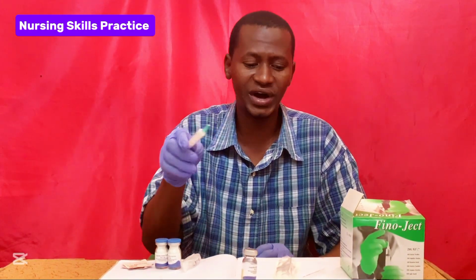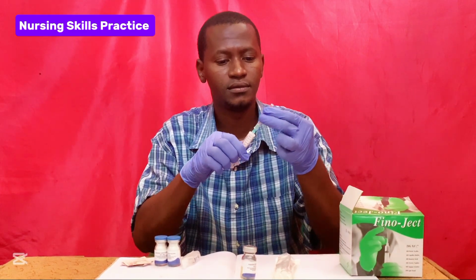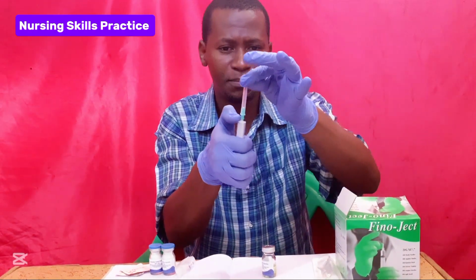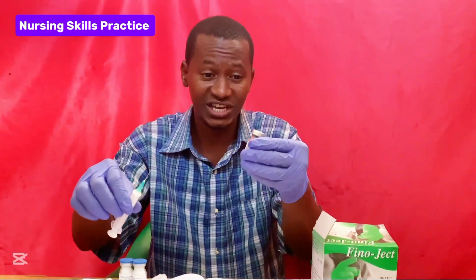When you finish diluting the drug, you have to withdraw the drug from the vial. Okay, let me show you how you can simply withdraw the drug from the vial. First you get the syringe together with the needle. You remove the cap of the needle first. Then you get the vial containing the drug.